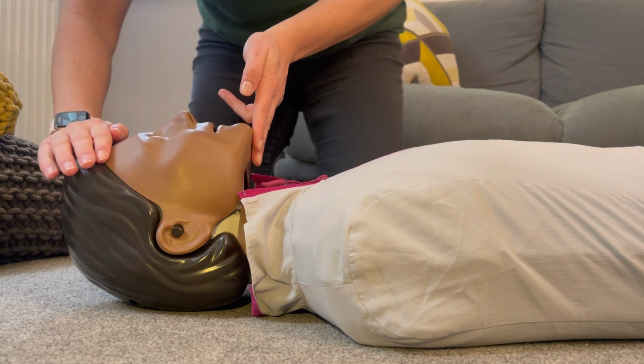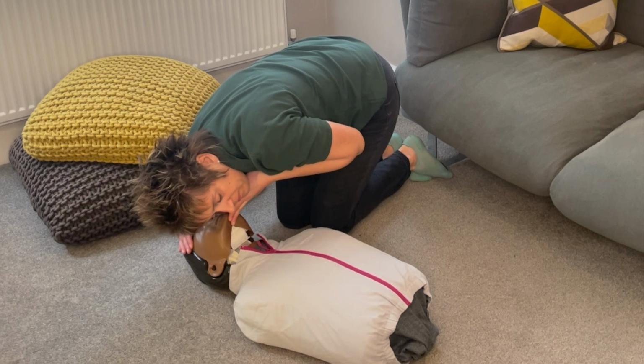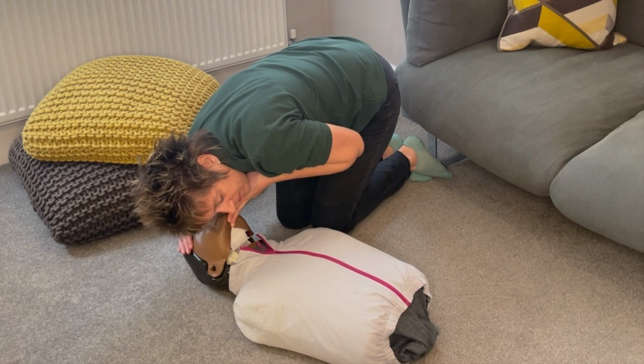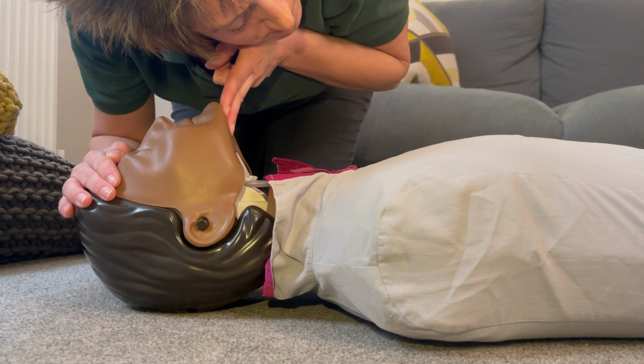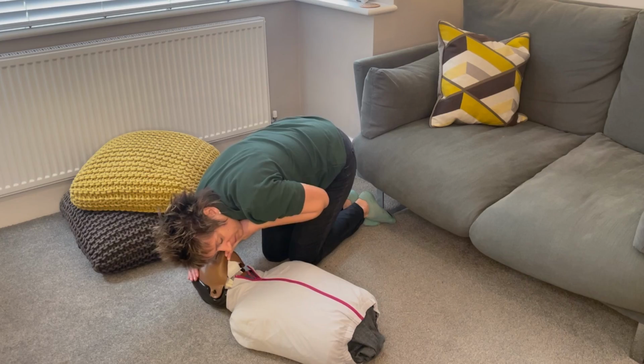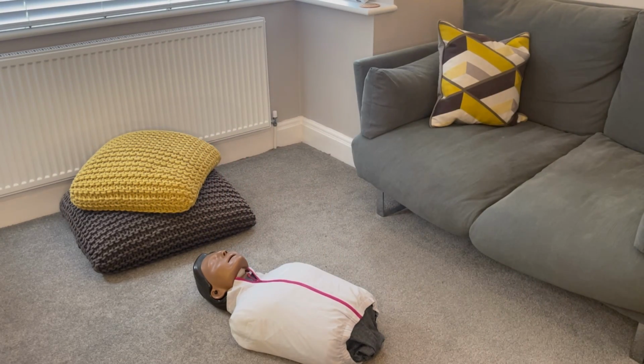I open the airway with a chin lift and a head tilt. And then I look, listen and feel for breathing for up to 10 seconds. So I'm looking at their chest rising and falling. I'm listening with my ear and I'm trying to feel for breath on my cheek. Now this casualty is not breathing. So I leave the casualty now and I go and call the emergency medical services and I make sure I grab the AED, because there's one easily located that I can get in a few minutes.